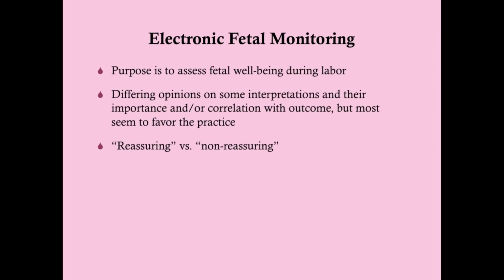All right, so what is the purpose of electronic fetal monitoring? Basically, it's to assess fetal well-being during labor. Now, there's a little bit of a problem with electronic fetal monitoring, and that is, while it tells you very well that the baby is doing okay, it's very good at that, it doesn't necessarily tell you definitively that the baby's not doing okay. In other words, there's a lot of false positives.